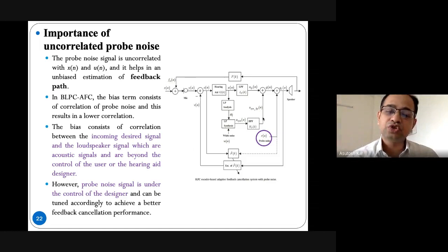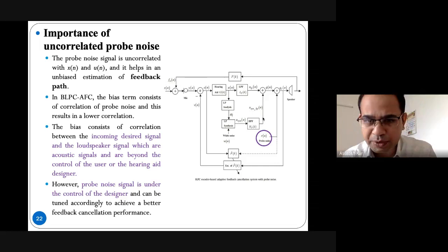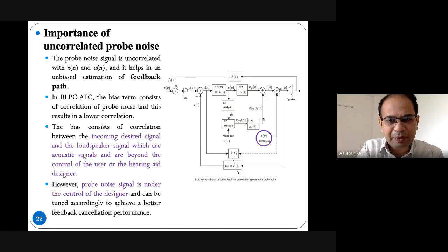So this is a peculiar signal. When we add it to the original signal, which has got some correlation, it masks the signal. And it does the masking in such a way, because these are signals, not just mathematical terms like 2 plus 5 that get added. Here we are inserting, masking the signal. When we add the signal properly, what happens? This masking reduces the correlation and feedback gets reduced.